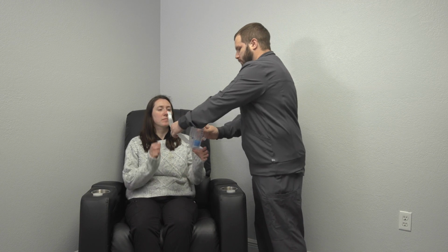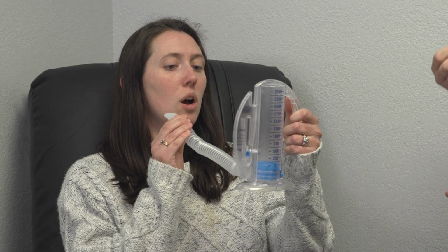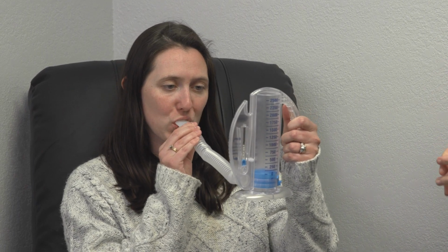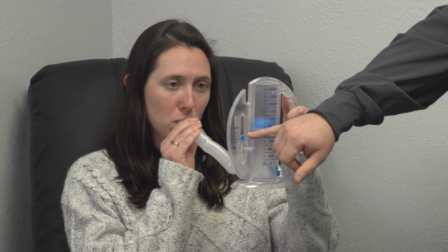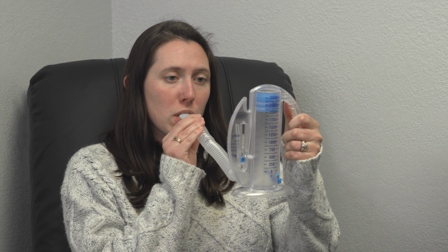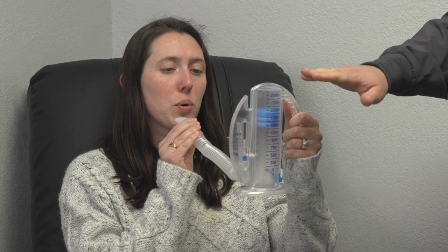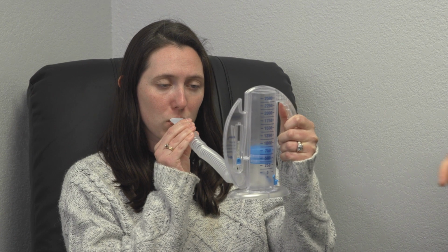I'm going to have Kelsey, my patient, demonstrate how to use this as I give step-by-step instructions. You're going to hold the device facing you, put the mouthpiece in your mouth, and take in a nice steady breath, not too slow, not too fast. As you notice, she's taking in that breath, that little tab is floating between those two arrows, and the blue bar is rising. She'll go in until she can't breathe in any deeper, and then she'll exhale slowly and let that bar drop. Once it gets to the bottom, she will redo the deep breathing process.